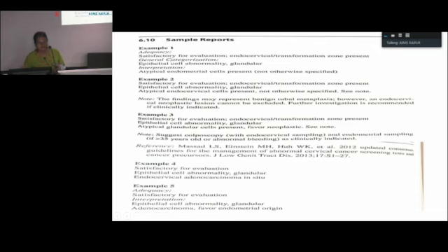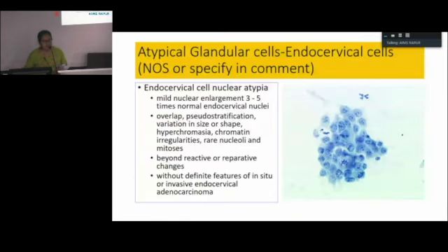Put it into its general category for glandular lesions, which is epithelial cell abnormality glandular, and then interpret it into its subsequent subcategories, which can be atypical endometrial cells present, not otherwise specified, etc. So this is a pattern for reporting. Now we look at the cytomorphology of all the lesions that I have listed down.